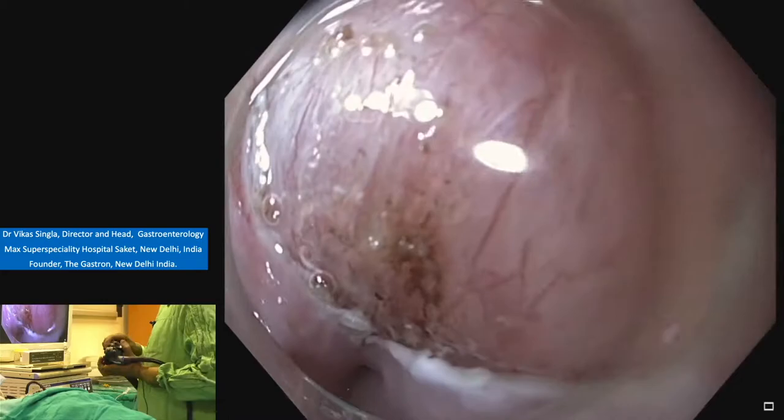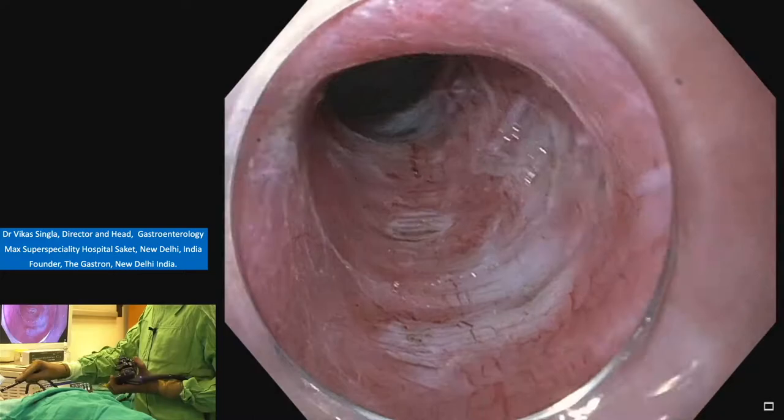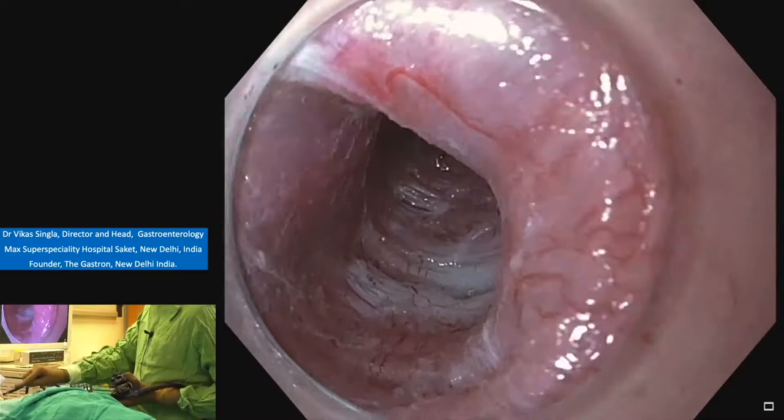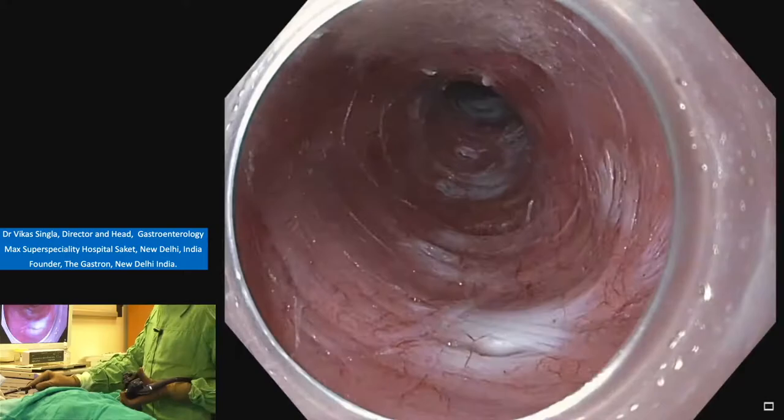Difficult entry because it's not a very dilated esophagus. Okay, yes, yes. So that's it. And so we'll do the around 5 cm myotomy on the esophageal side. So that's the GE junction, seems to be the GE junction. Pull back at around 38 cm. Pull back, now we are at 33. So we'll do 5 cm myotomy.